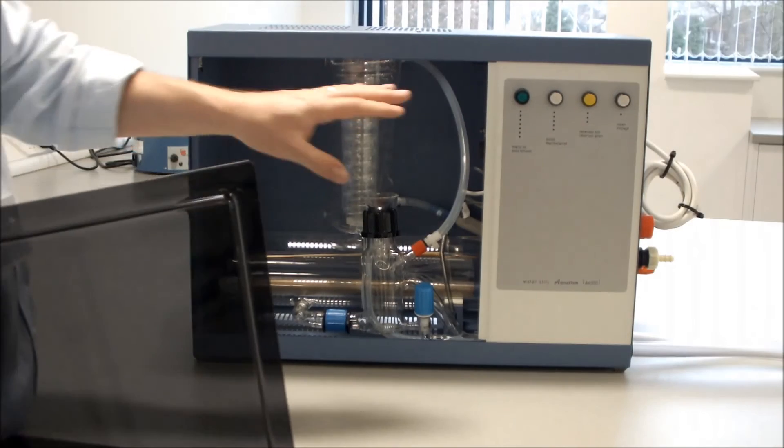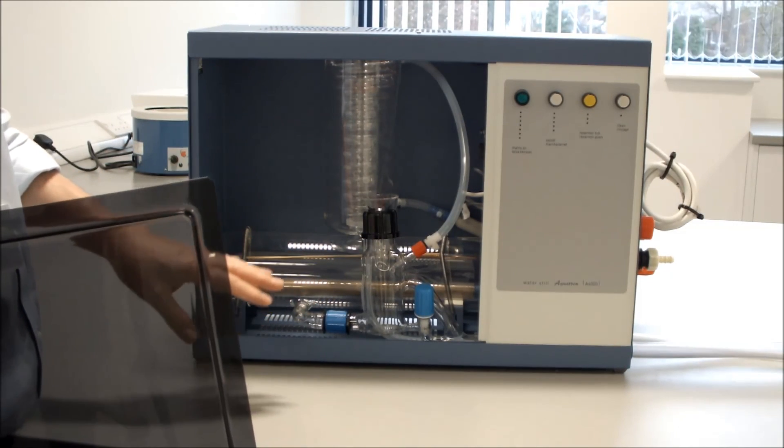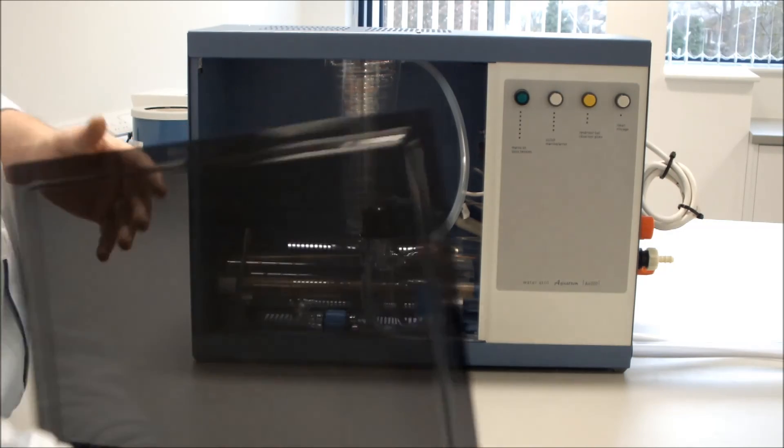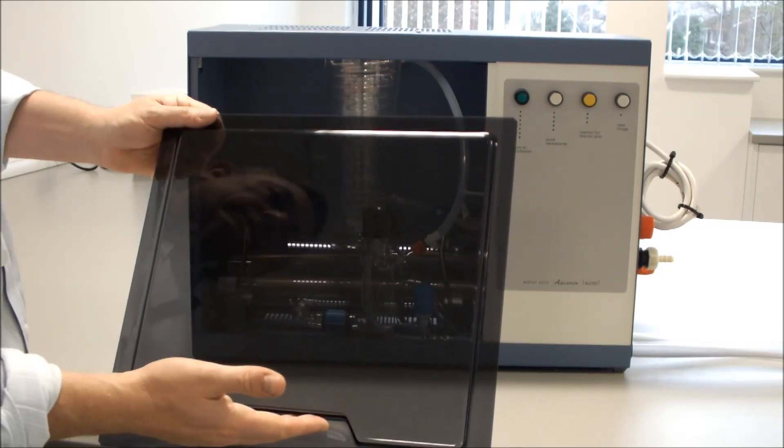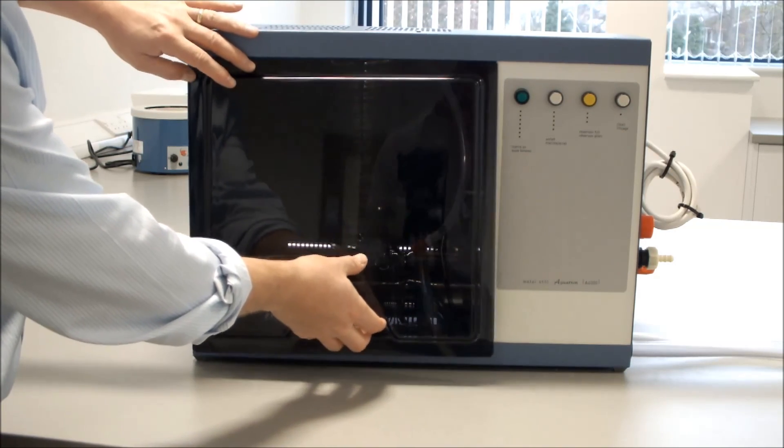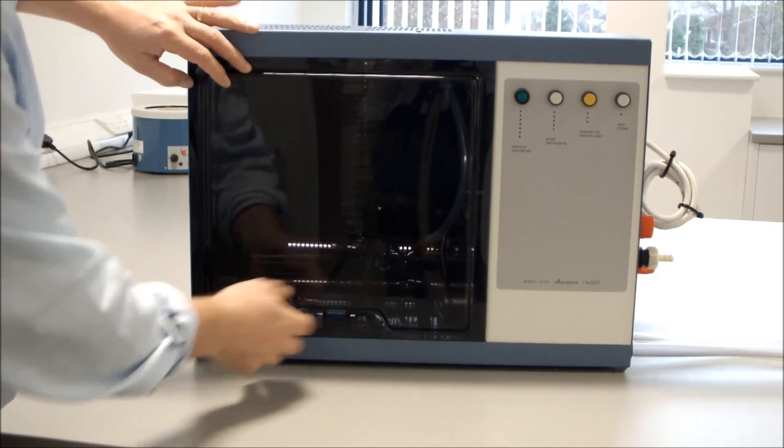The last thing to do is obviously get your Aquatron up and running. Make sure there's no leaks. Everything is working correctly. And the final thing is to put our Perspex fascia on. Again, that is just lift it up and drop down.